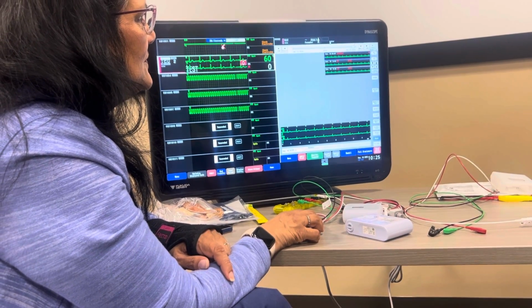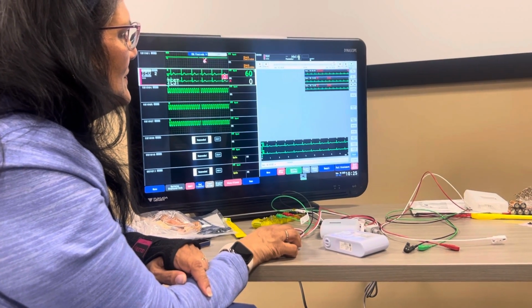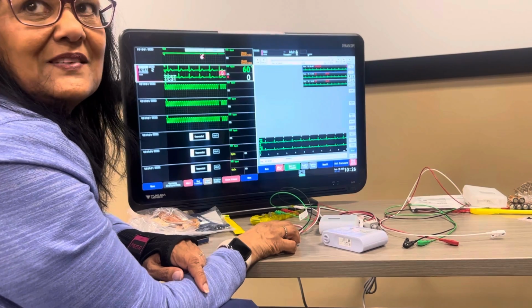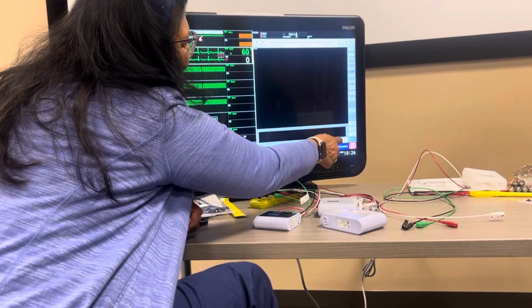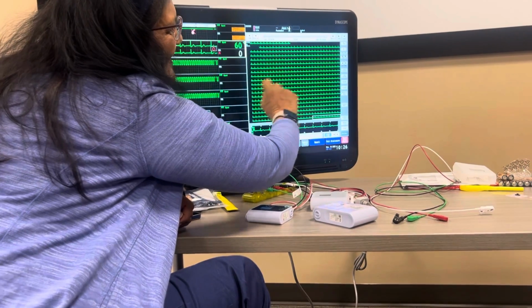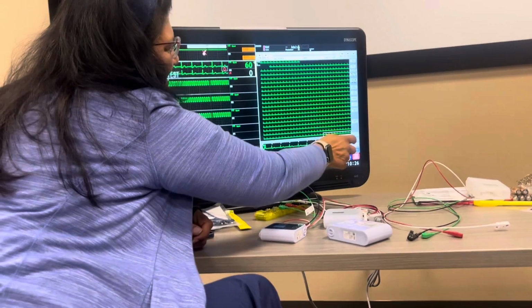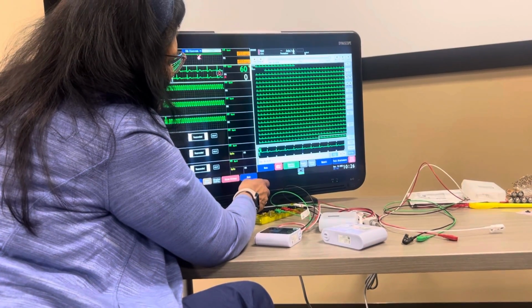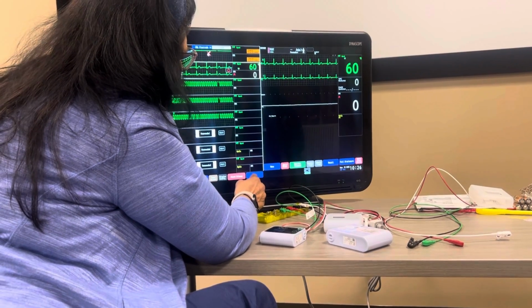Yeah, there's some kind of, I feel like my eyes are going, I'm having a hard time reading it. With this, we would go to full disclosure, and then you can do time search. Yes, the biggest one to read. Full disclosure and then time search. Right, and there it is. You can change the date and the time, and there are dots where the alarms are if it doesn't immediately come to you. Yep, perfect.